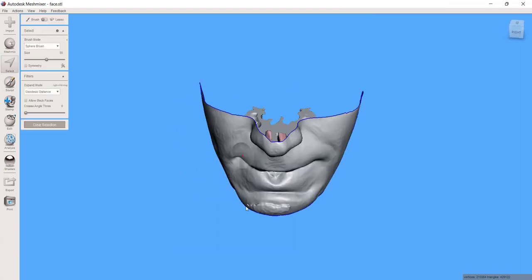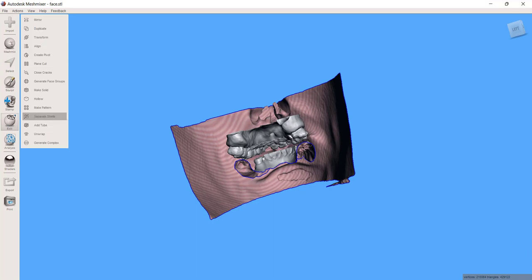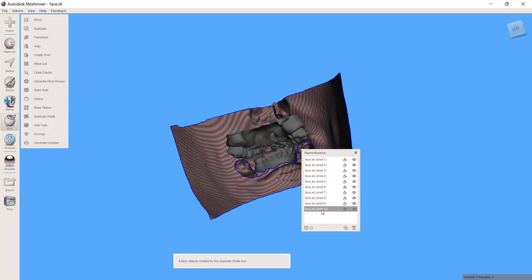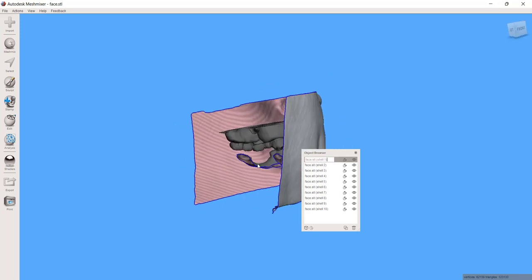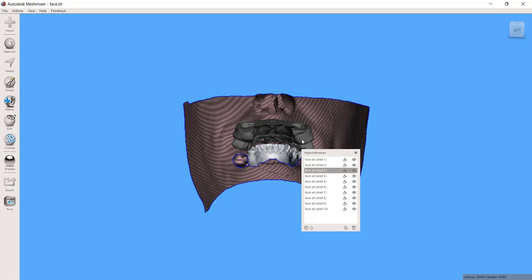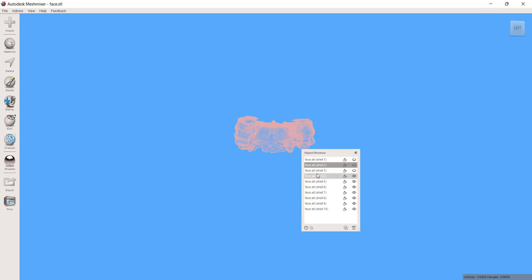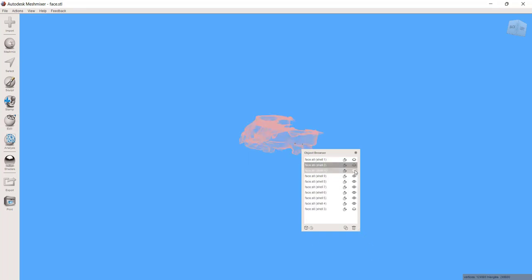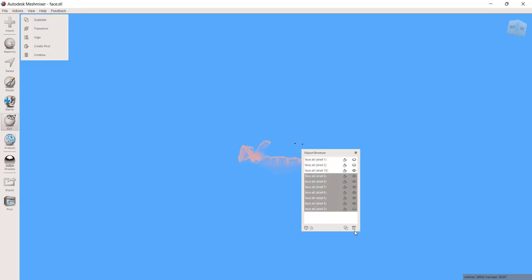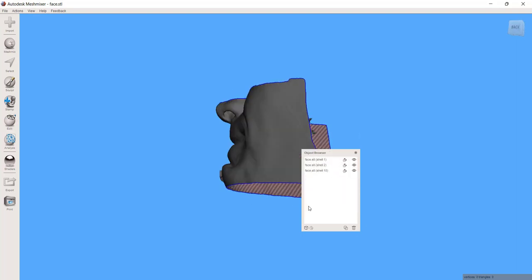What I'll do right now is I'm just going to separate all these files. So if I just go to Edit, Separate Shells — and now I have the face, the lower arch, and the upper arch. If I hide those, there are just some little bits and pieces of mesh, so I'll just delete all of those. Now we've got the files that I wanted to work with.